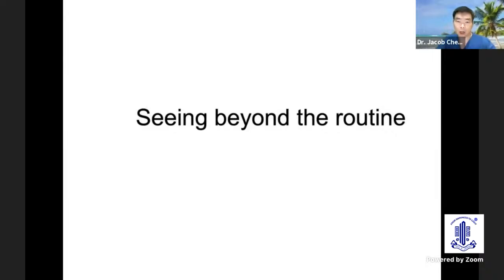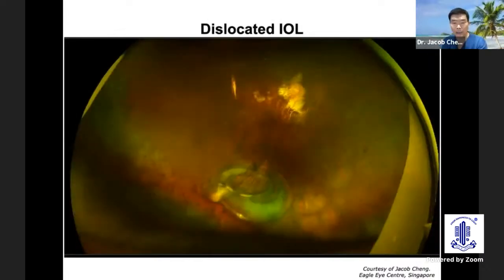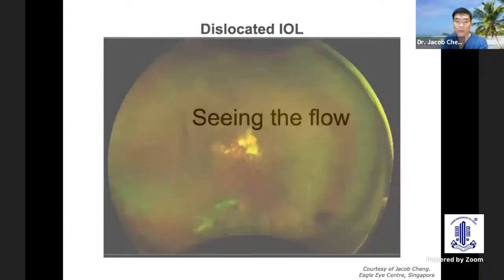How about seeing beyond the routine? Again, an earlier speaker has also mentioned that a patient with RP, or retinitis pigmentosa, has weak zonules. And here we can see imaging of the periphery of a dislocated lens, with the RP picture and a dislocated lens in one picture.